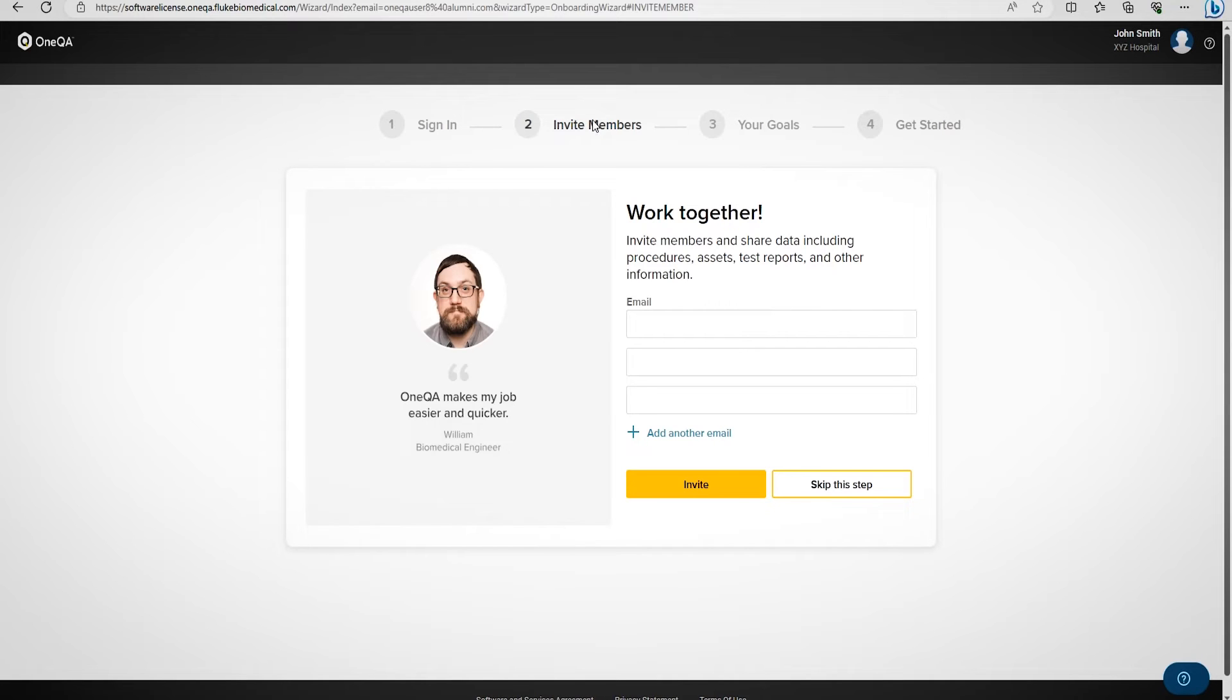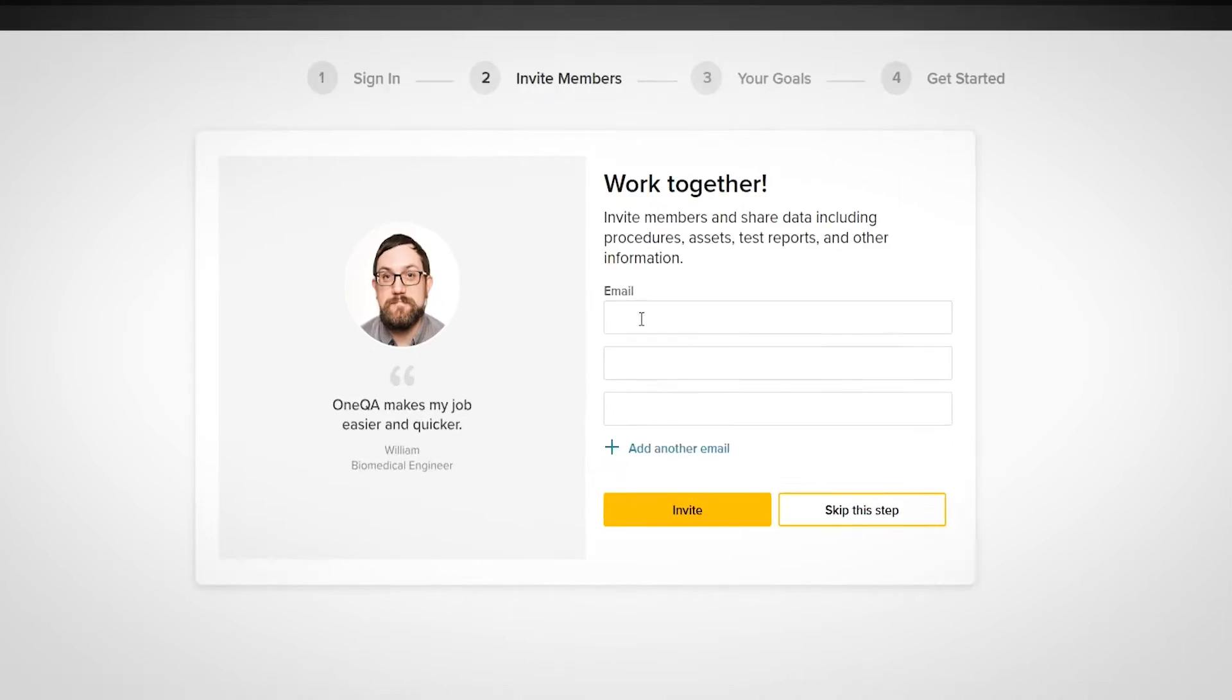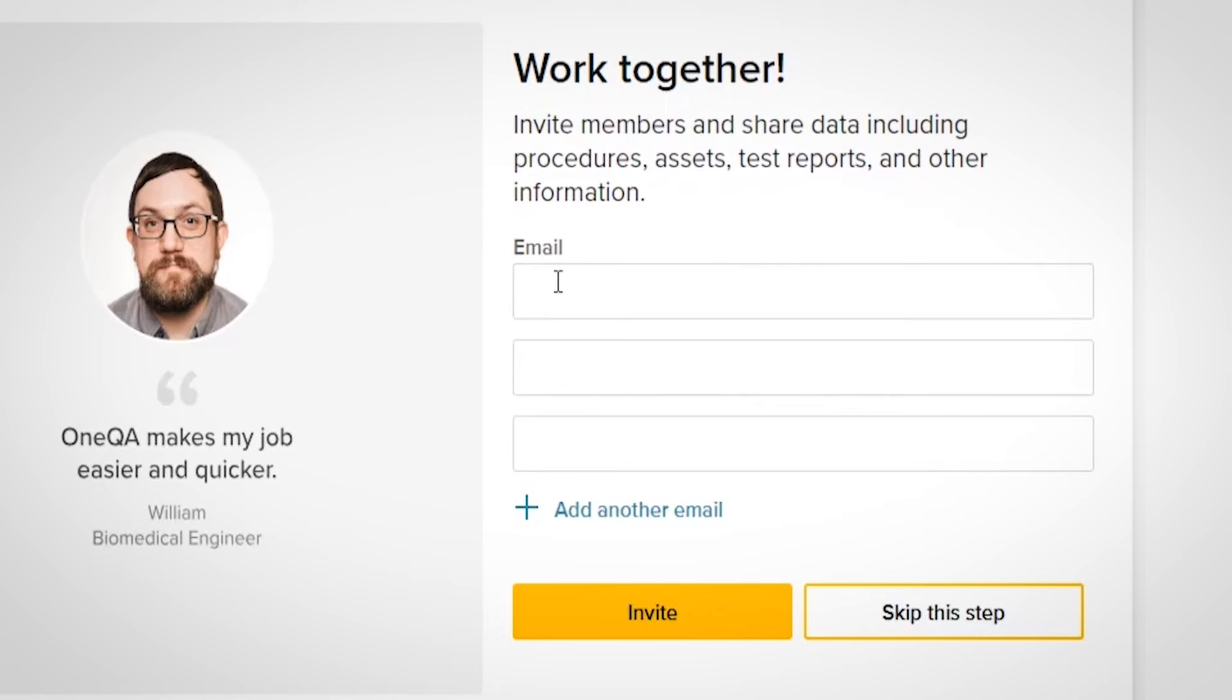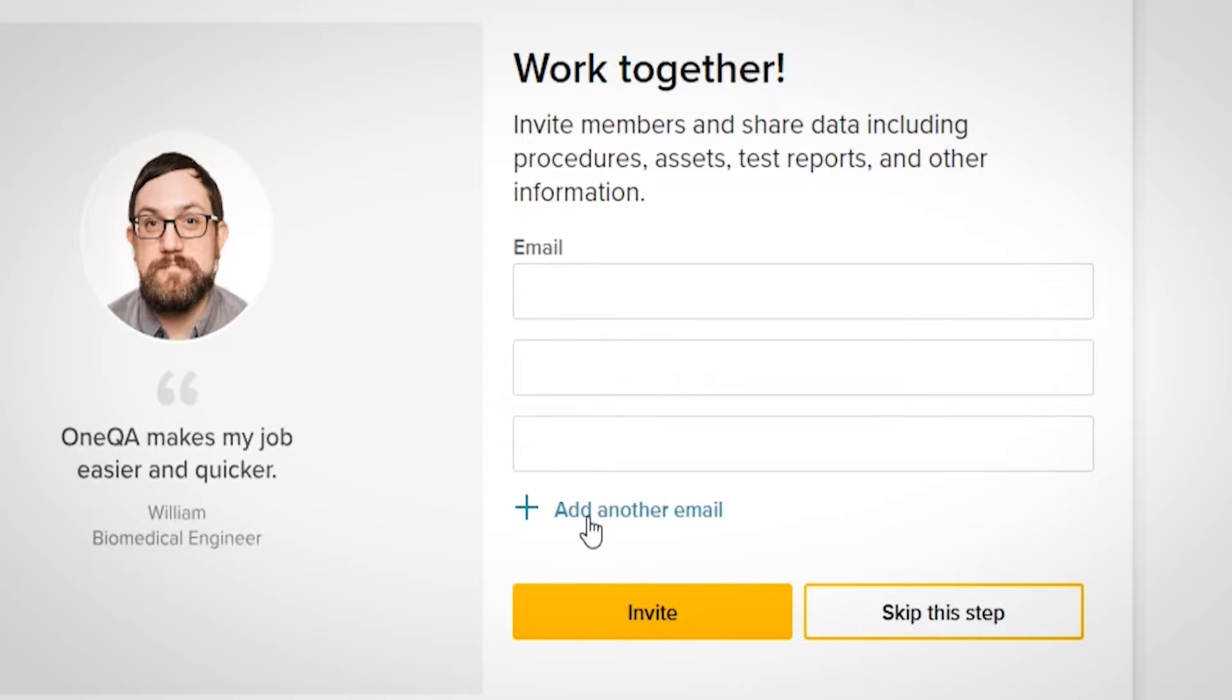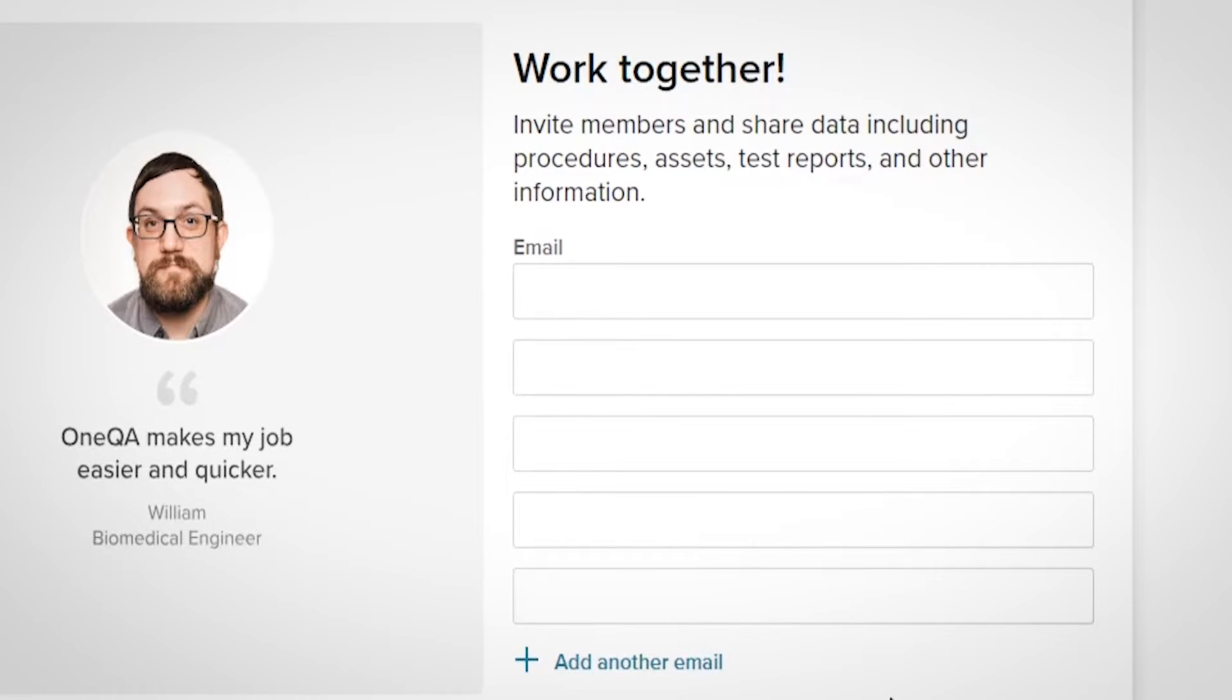Now we have Steps 2, 3, and 4. In Step 2, you have the option to add your coworkers' email addresses. This will invite them to join the portal. You can add multiple email addresses if needed, but for now, we'll skip this step.